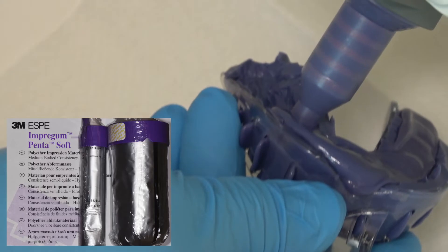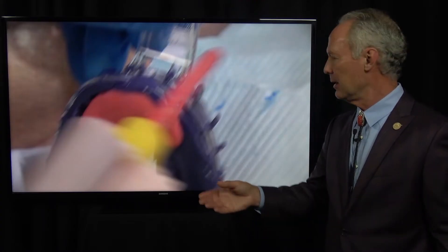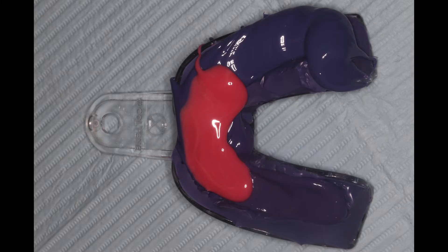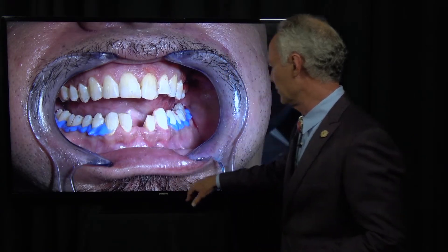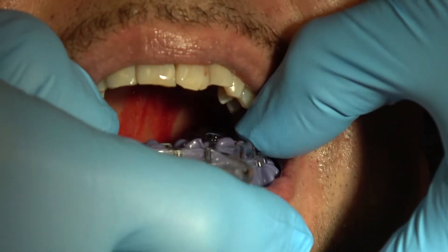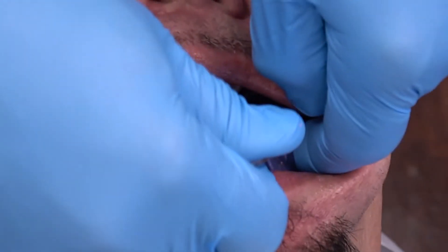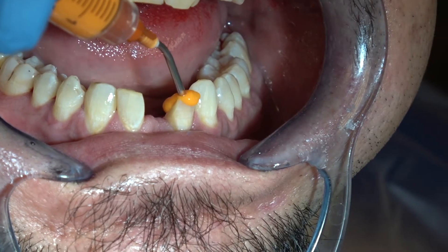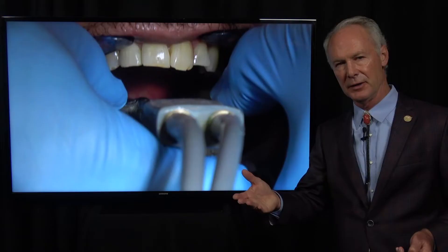We're going to take a polyether with custom tray impression using wash material. Rinse the teeth really well - polyether loves water, so a wet tooth is fine. Polyvinylsiloxane does not like water - it's hydrophobic - but polyether is hydrophilic. Be sure there's no dried blood or anything in the gingival sulcus. I'm placing blockout material on the posterior teeth. I'm not squirting wash material directly on the teeth, just using the wash material in the impression - it is deadly accurate.